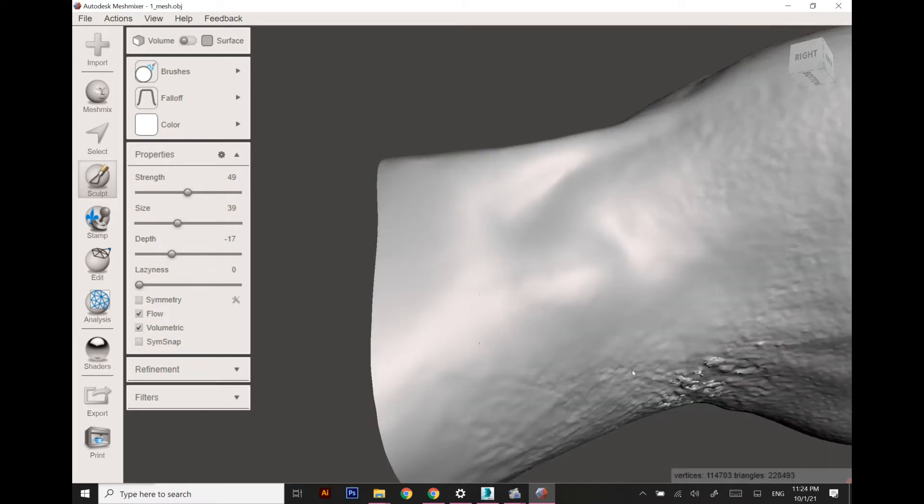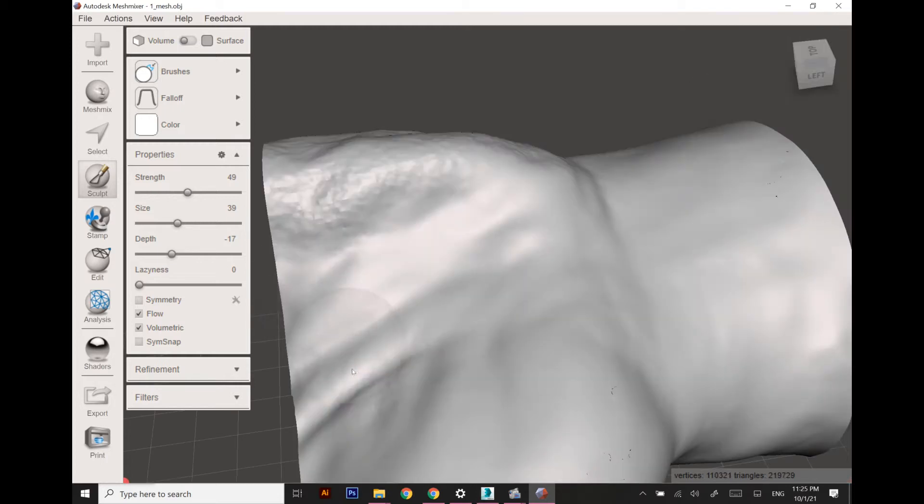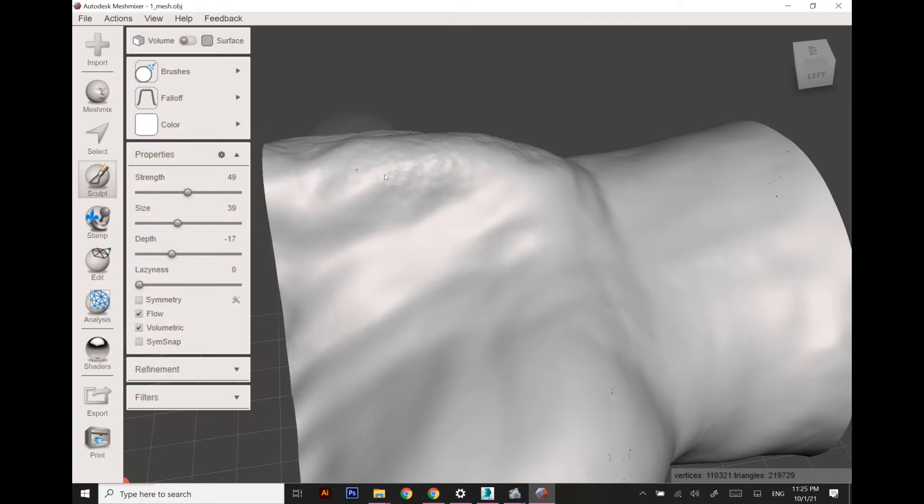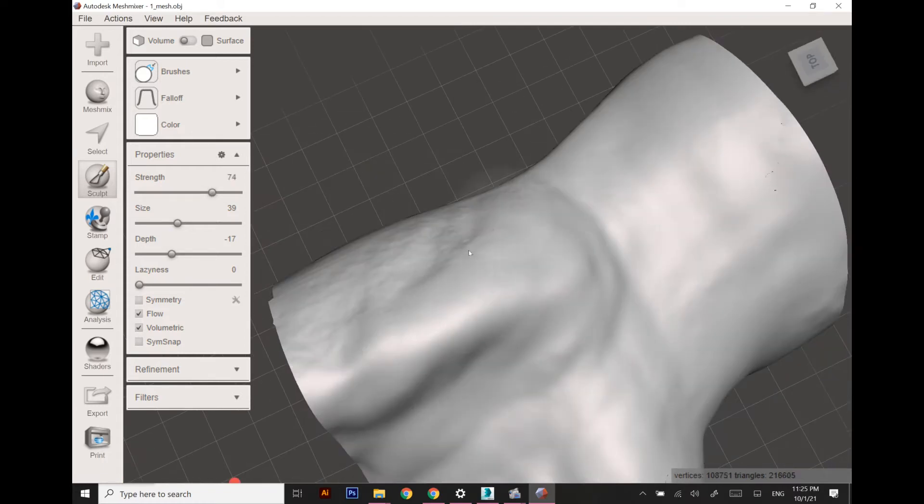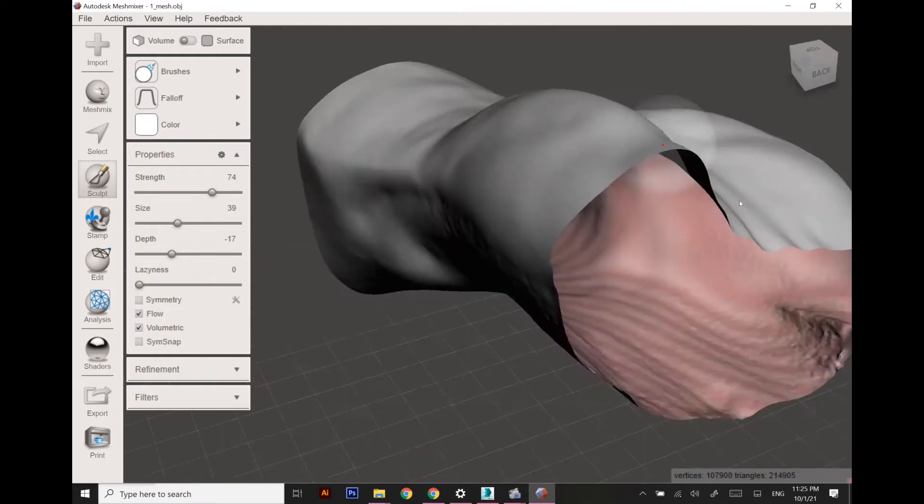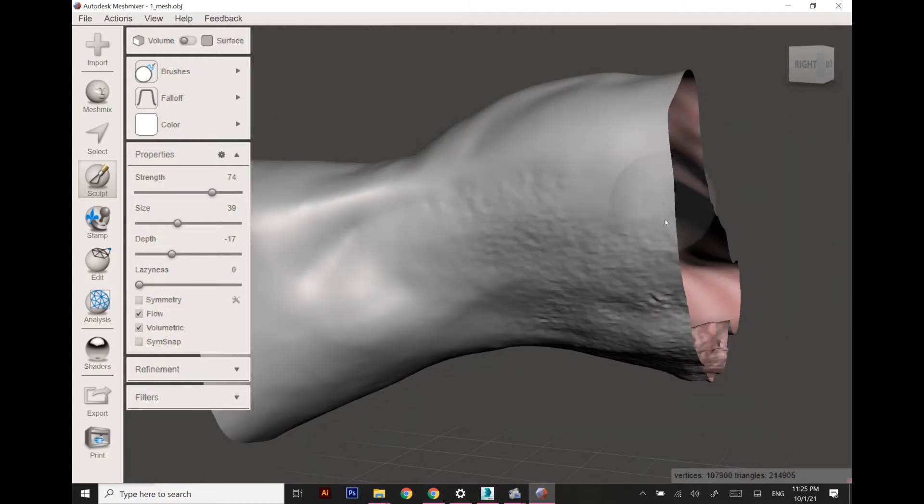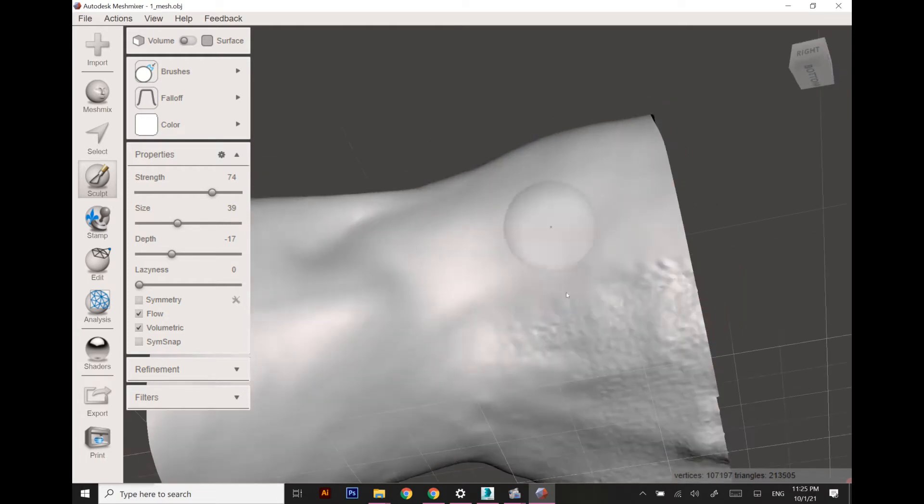There are some bubbles on the backside of the hand and these are my palm lines, so I'm going to smooth them out.